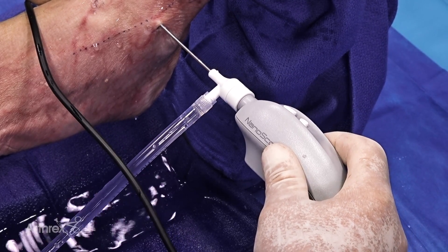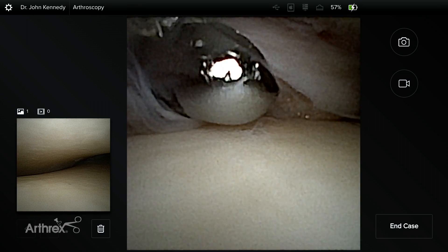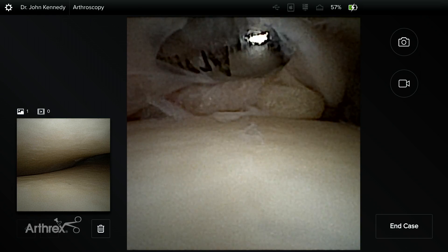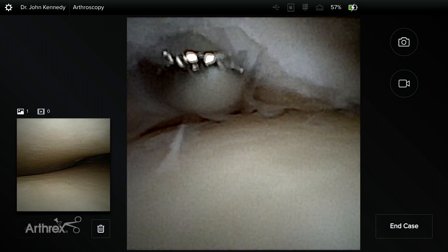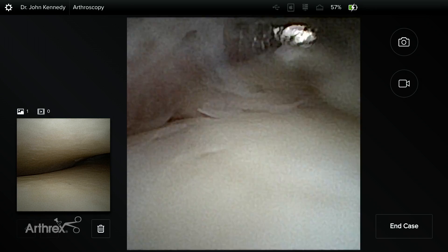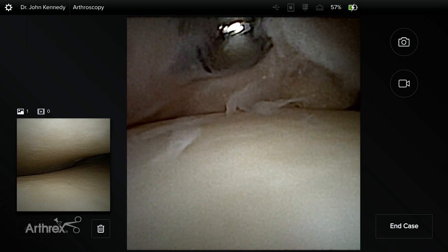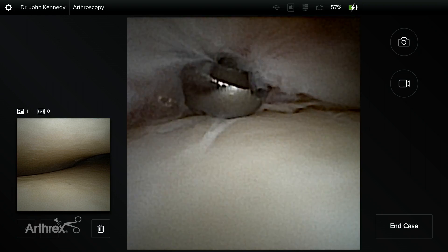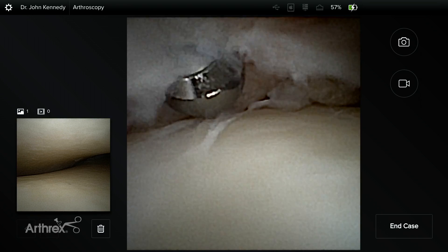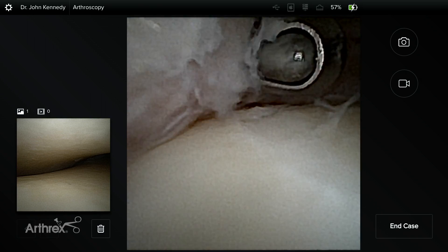On the medial side, we've just switched the portals very easily. We're going to use again the two millimeter shaver to clear away all of this scar tissue — this is typical for anteromedial impingement in an athlete. Athletes don't want any downtime, and you can see how you could do this very easily in the office under local. Literally right afterwards the patient can walk out. There are no sutures, so the risk of infection is lowered and the recovery times are consequently far faster. The imaging quality here is really terrific — we're able to see every bit as well as if we had a larger scope in the operating room.